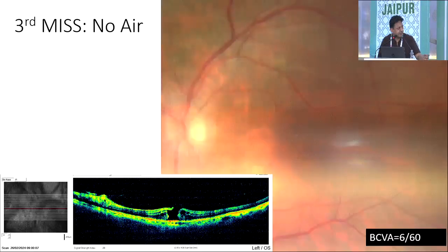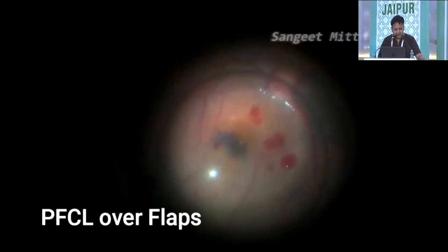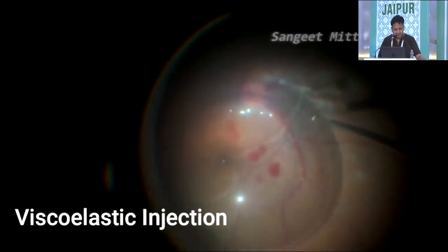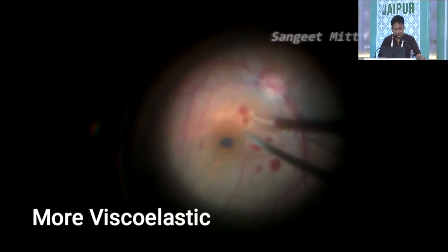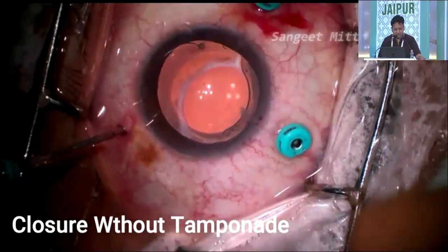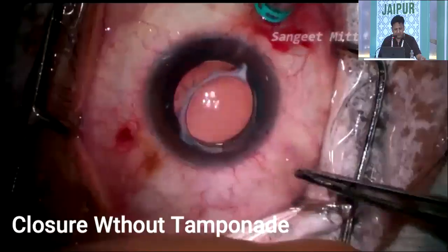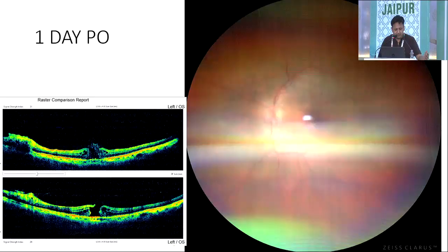Suddenly my air pump froze and stopped. PFCL was used to stabilize the ILM flaps, which were then inverted under the bubble. Viscoat was injected around the bubble. PFCL was aspirated slowly and more viscoelastic was injected over the flaps. Closure was done without any air or gas tamponade. So I didn't use any air or any gas, and this was 1 day post-operative.